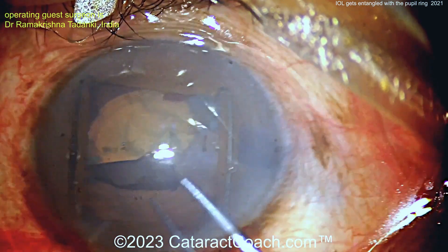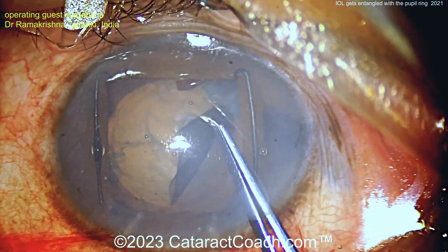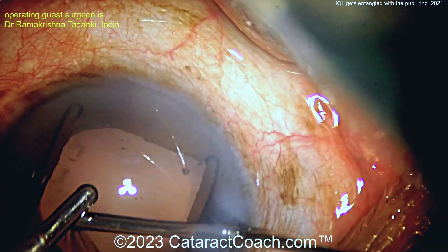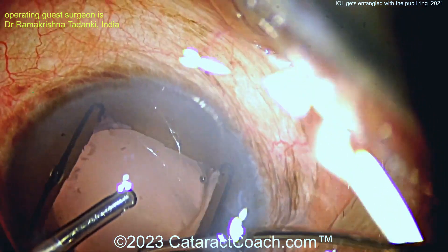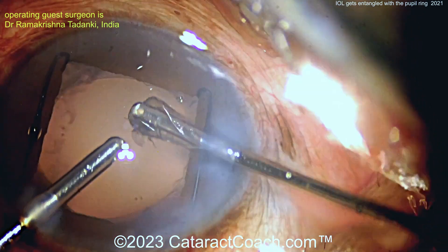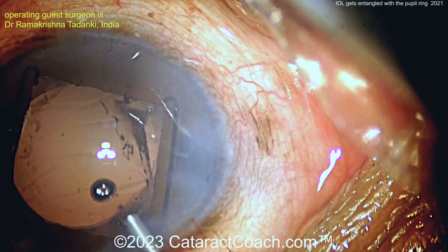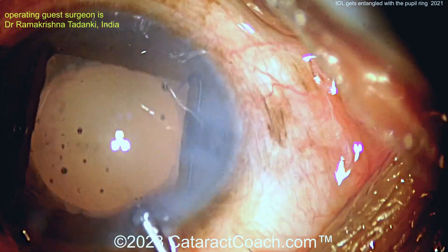Not sure exactly what the size of this ring is — in the U.S. the Malyugin ring is available in two different sizes. Let's fast forward to the end of the case. Cleaning up the capsular bag by manual IA for cortex removal. The pupil expansion ring is still in good position and it's not engaging the capsular rhexis, which is good. Now here's the viscoelastic, getting ready for IOL implantation. The rhexis is free.